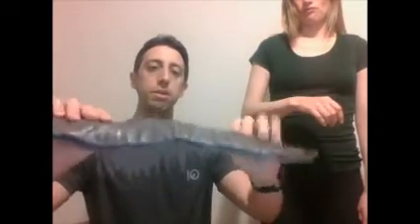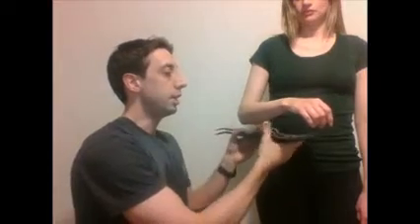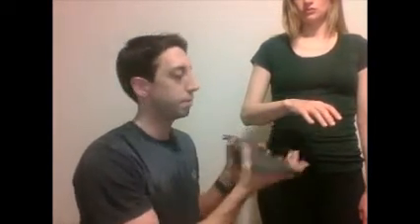The option that we are going to use is something that looks like this. Again, this is another commercial product. It comes out of a sterile packaging and it is padded. There's some aluminum inside that gives it some form. So I don't want to be manipulating this injured side as I form the splint. So instead, what I'll ask the patient to do is hold the other arm up into kind of the same position that they have, so that I can use that side to form the splint.